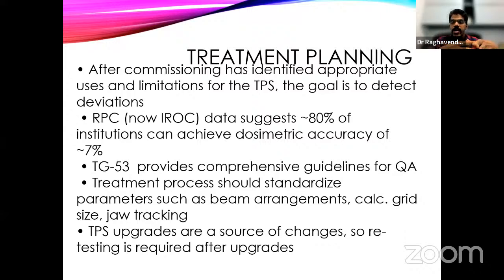Once the model is done, definitely dose calculation is also accurate. Now we are into the third generation, or we can say gold standard, where I don't need data at all. I need data only for verification. That means the machine is modeled using Monte Carlo codes.